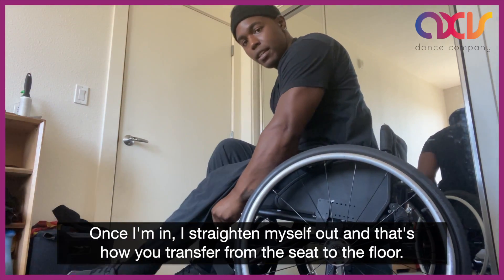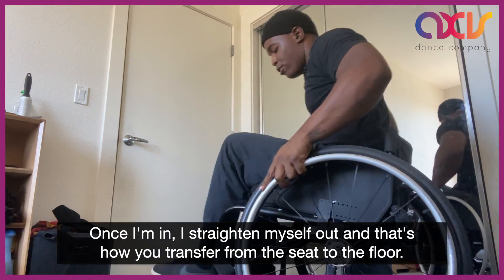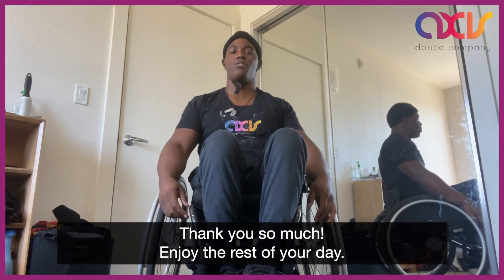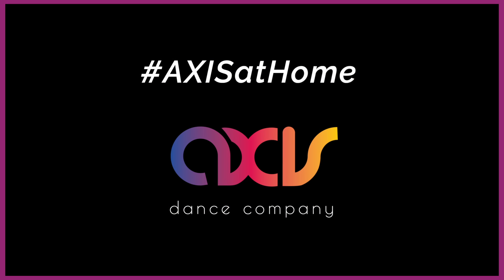Once I'm in, I find that I straighten myself out and that's how you transfer from the seat to the floor. Thank you so much. Enjoy the rest of your day.